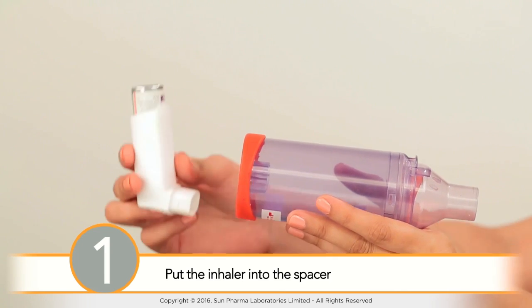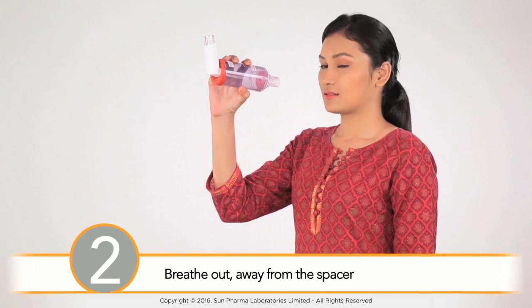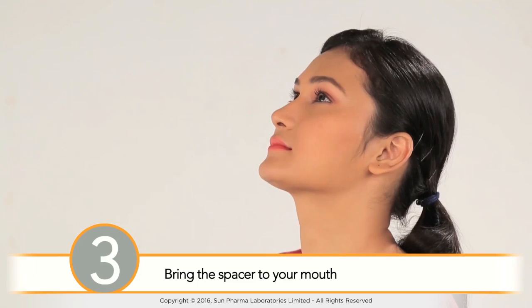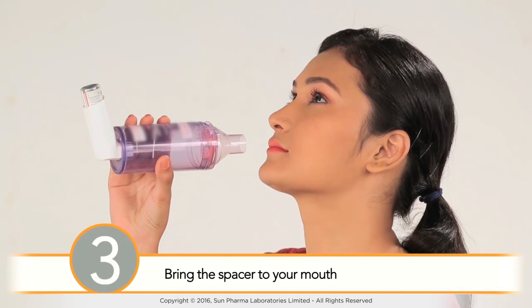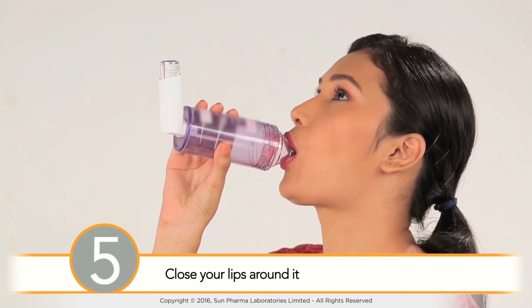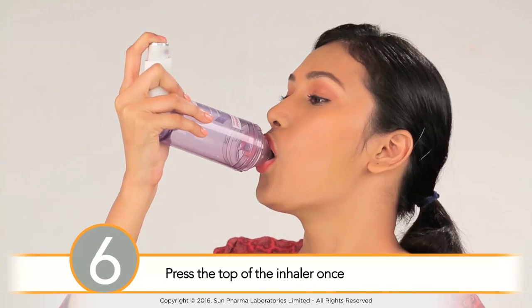Next, put the inhaler into the spacer. Breathe out away from the spacer. Bring the spacer to your mouth, put the mouthpiece between your teeth, close your lips around it, and press the top of your inhaler once.